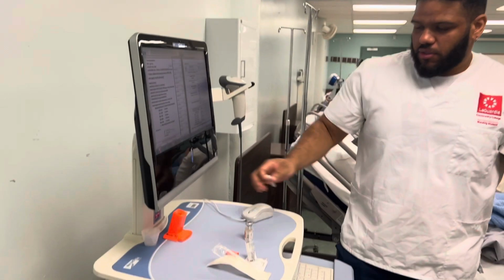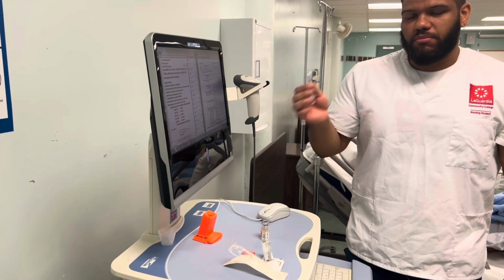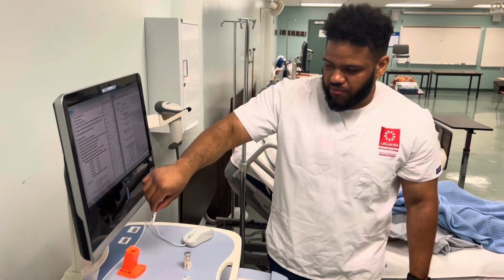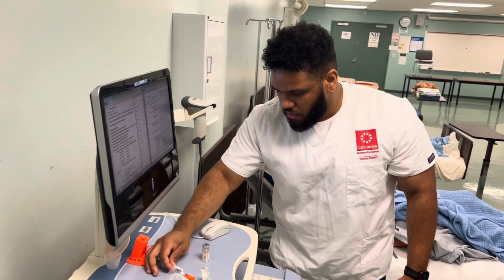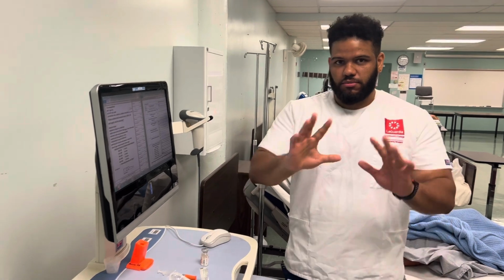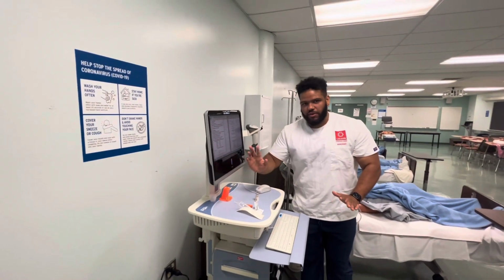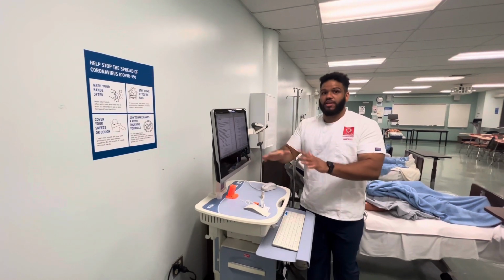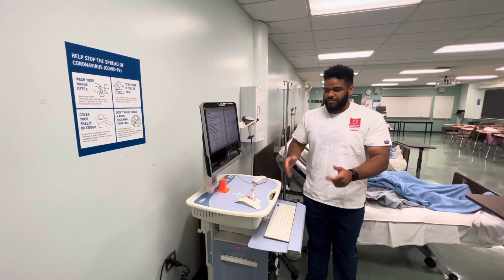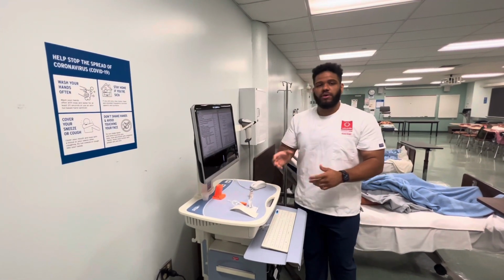Place that down. You see this little orange syringe stand here? You can, if it's an IM syringe, you can literally just plop it in there, but this won't fit. So we're just gonna put it right in the orange cap. This is not technically recapping, okay? Just for clarity, do not recap your needles. But I'm placing it on there just so I know that it doesn't touch any other surface. And then from here, we can either perform our third check here before cleaning up and everything, or we could do it at the bedside.